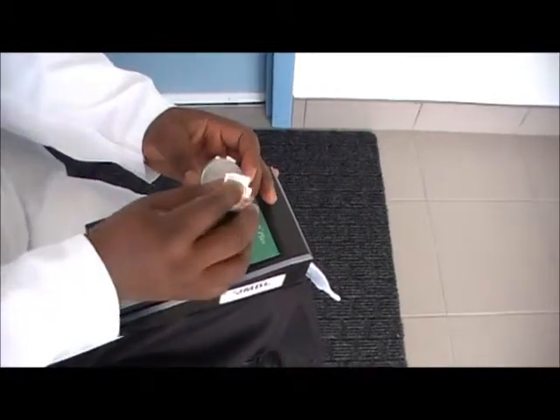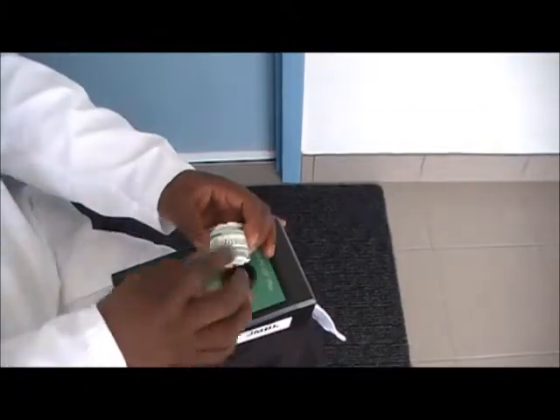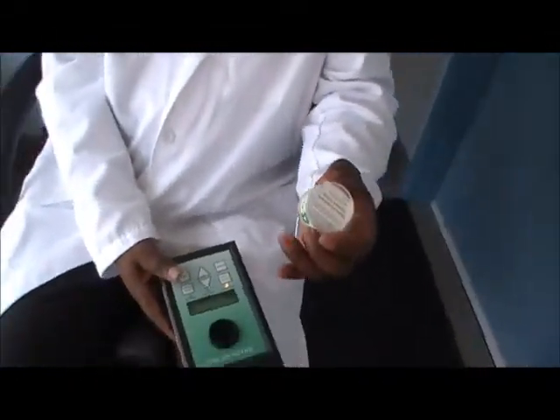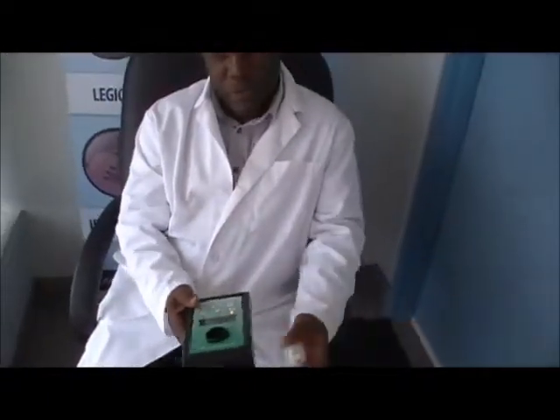The next thing to do — so that you don't forget — is to label your cassette. For example, if this was from your kitchen, you would label it 'kitchen.' Then you go to the next sample if you want to take another one, for example from your bedroom.